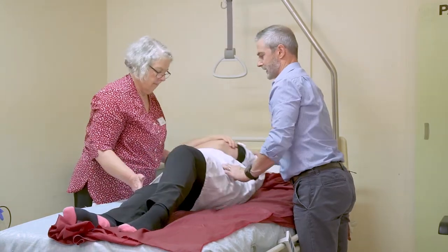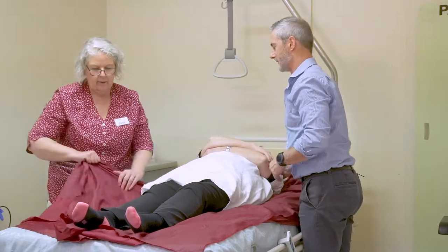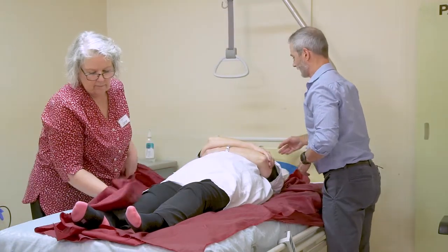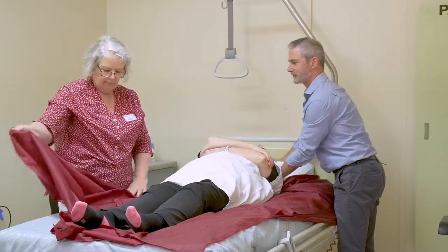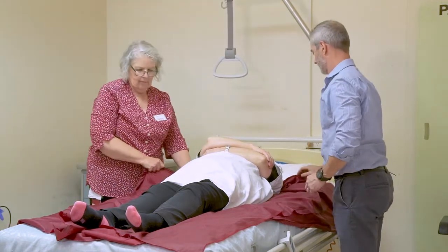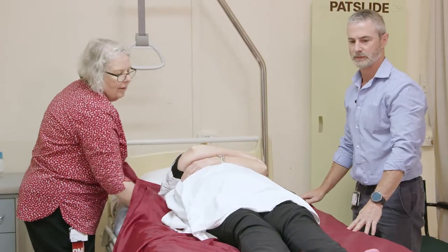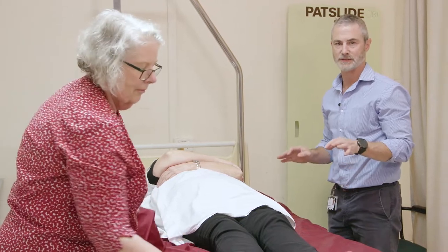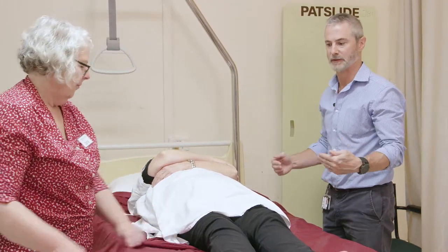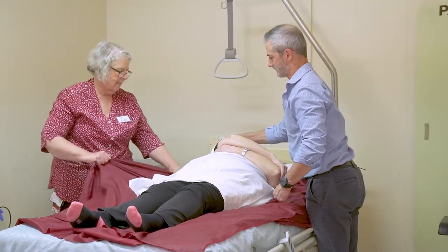Roll back onto the patient's back and from the bottom end, bring the slide sheets out. This is the same roll when positioning a sling or a hover mat under the patient.